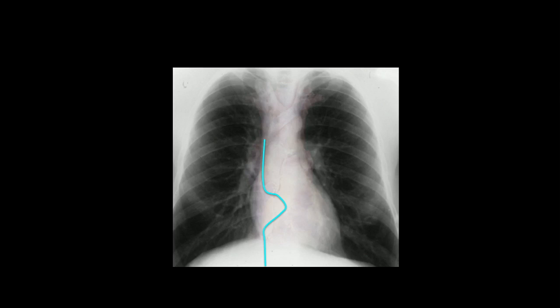Okay, it's not Fontan. That's not a bad guess, actually, because that could be like a lateral tunnel Fontan. But this is classic for what else? It's adult congenital Mustard, exactly. So remember how she said you put the pant leg here, and you bring it over, and the waist goes over to the mitral valve? It really is, like when you're trying to cath a person with a Mustard, you don't go straight up. You go this way, and then it curves over this way, and then you have to have a wire or something to help you get back this way and go up the SVC. So this is what it looks like for a Mustard. And this is the systemic venous baffle.